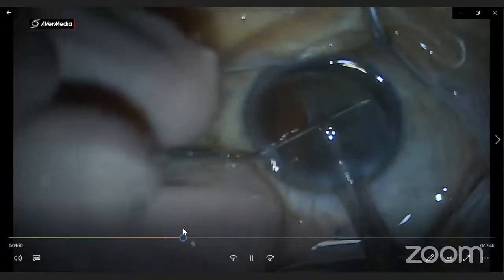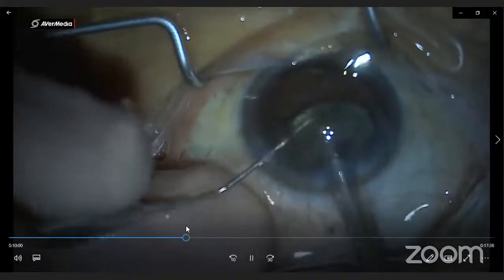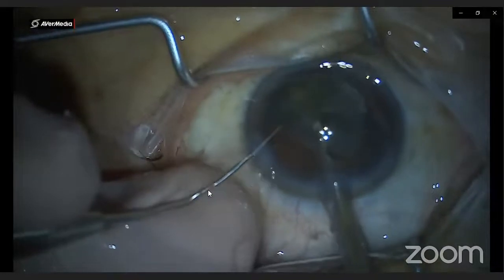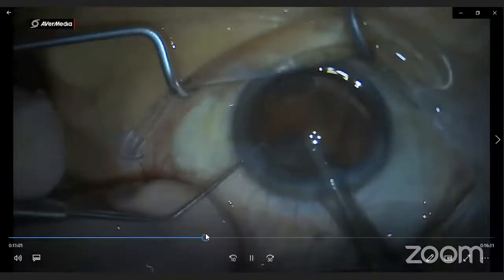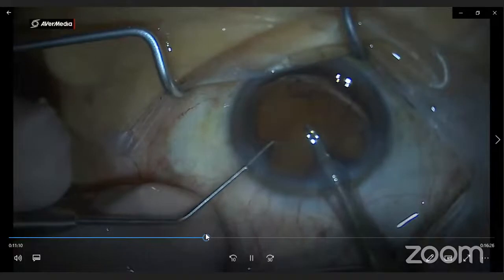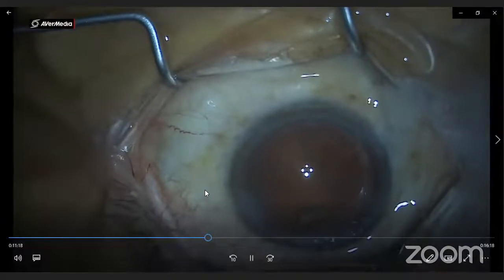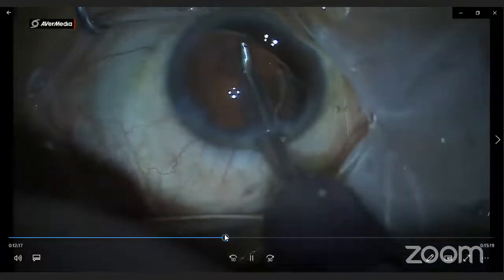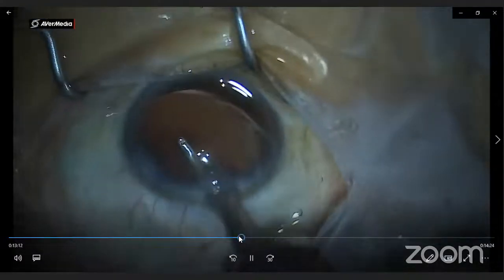I think macam tak ada apa-apa sangat kot Dr. Aziz. Sebab yang ini je video yang save okay, because yang dari OT2 tu yang lain macam tak boleh save. I'm not sure why. So hopefully after this I can record more. The lens inserted in this case was a toric. Cuma masa I/A tu, the sub-incisional tu saya a bit struggle to catch. In the end, I just left a small piece of it.